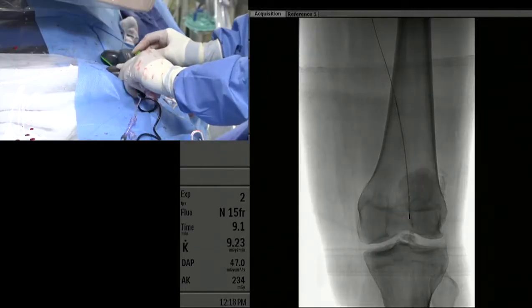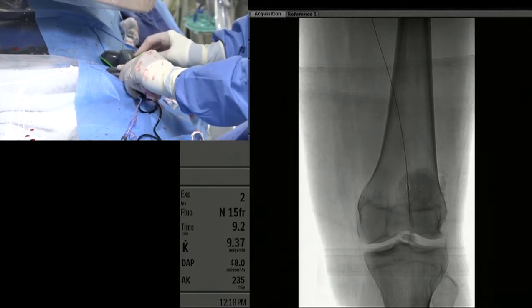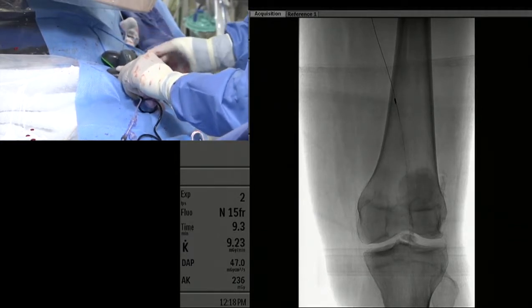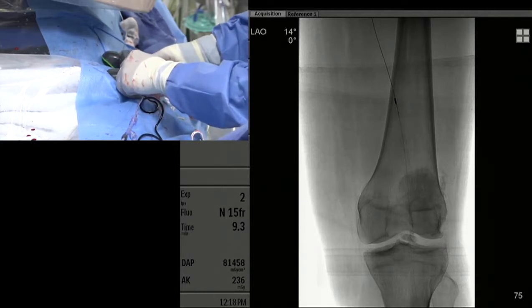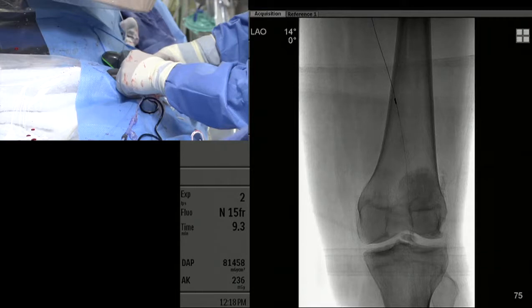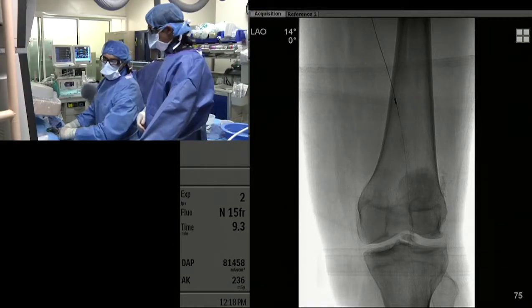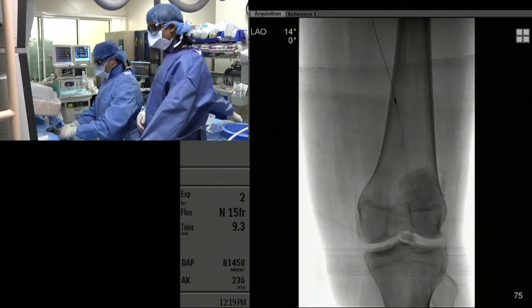You can see basically where the tibial plateau is and its relation to where the lesion is and the tibial tuberosity. We're just going to pass this through a couple of times. As we're doing the atherectomy, the system actually notifies us when it's time to flush, and we flush the whole system with the lubricant solution.